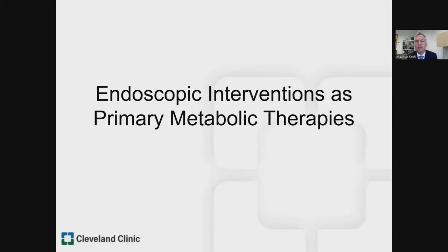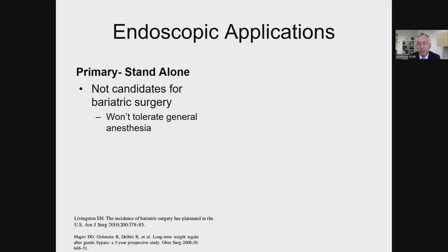And how about primary endoluminal intervention for treatment of metabolic disease? This seems to be a very promising area. I'm going to talk about some of the devices and technologies that currently exist. And this is a different group of patients that choose this intervention versus surgical intervention. From a primary standalone procedure standpoint, these may be candidates that won't tolerate general anesthesia or would not be able to undergo surgery, but most commonly, these are patients that simply don't want surgery.